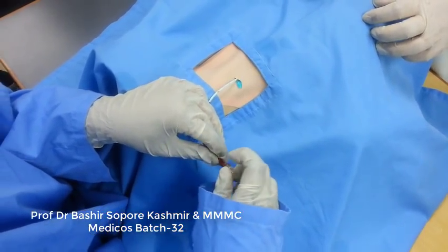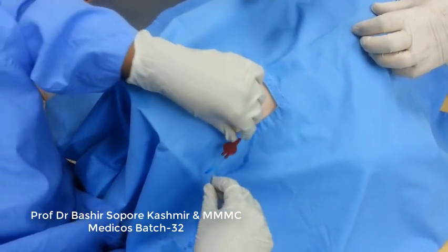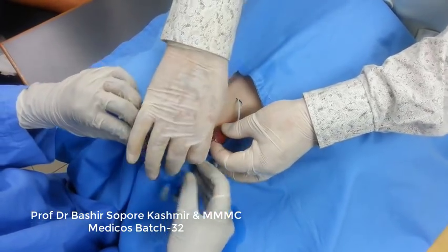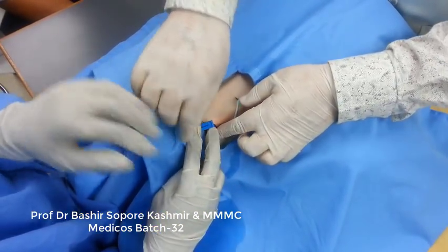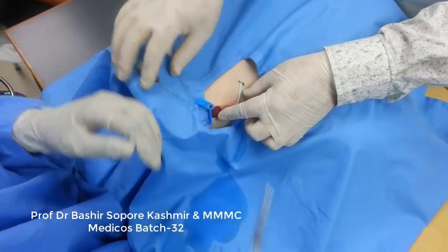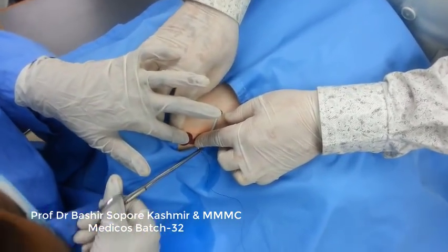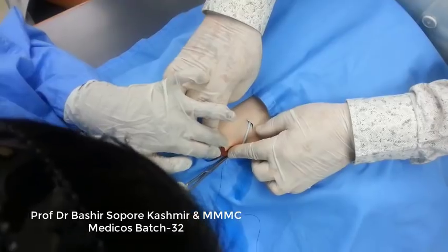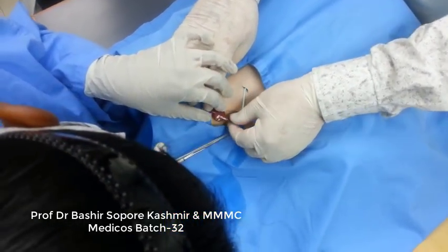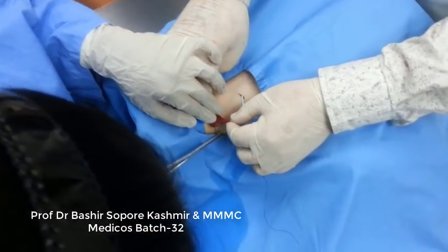Now we will suture the catheter, and we will anchor the catheter with the skin, isn't it? So it will be here, isn't it? For example, now you take the suture, needle is there. Okay, so we can suture it like this. There, the hole is there, isn't it? See, where is the hole? Here is the hole. Okay, first you take it from there.